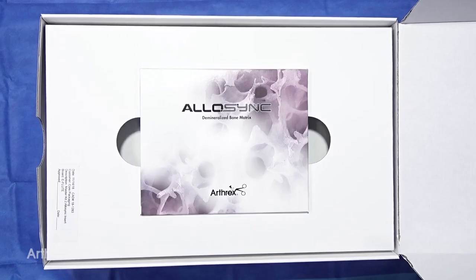This is Dr. Kirk McCullough from Kansas City, and what we're going to highlight today is the use of the BioSurge kit and the combination of the AlloSync Allograft system along with the Angel concentration system.